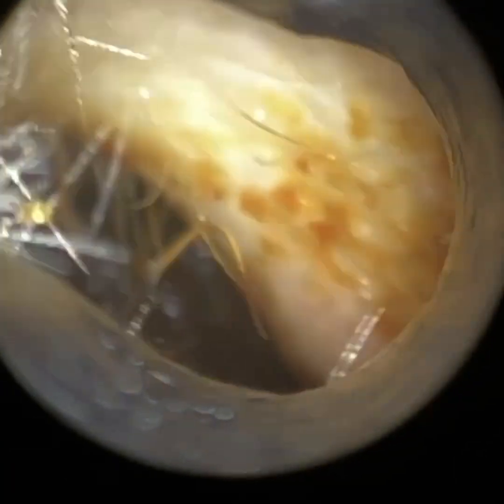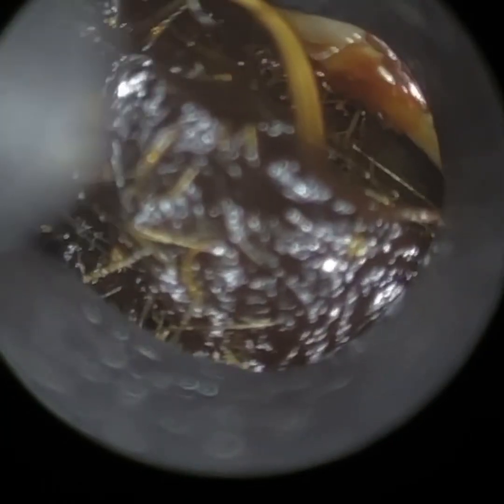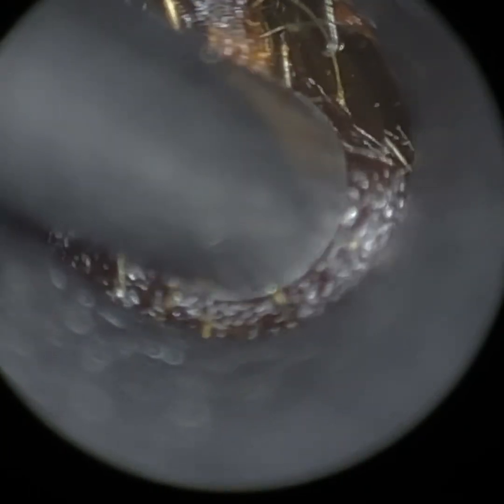Hello, this is Mr. Reiteter, Consultant Audiologist and Director of Clearwax. We have another demonstration video here of our newly developed WaxScape, which is due to be launched in early autumn 2022.